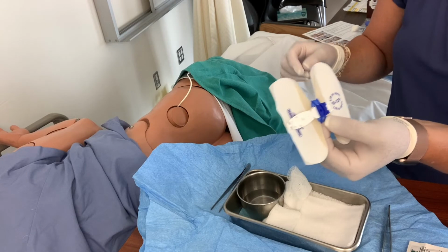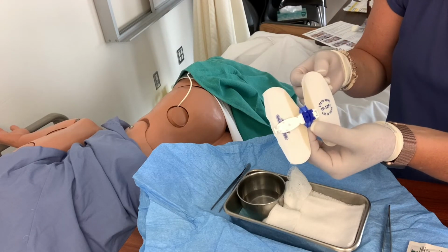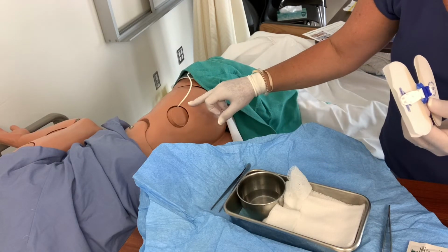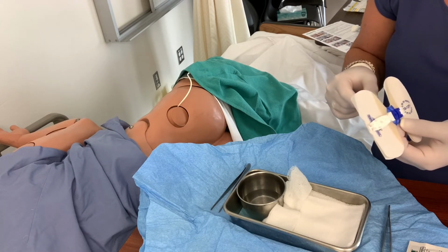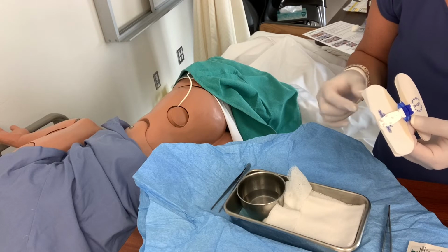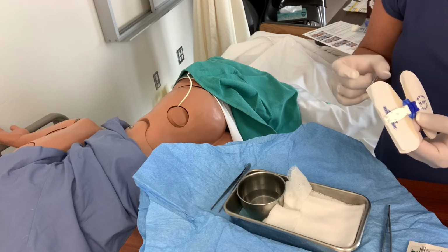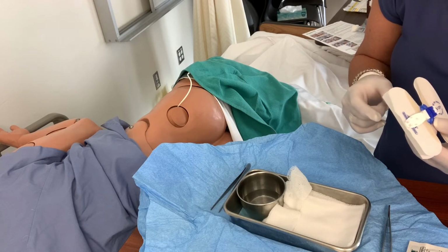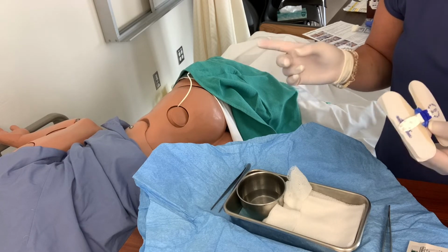So this is where you need to be careful that you're not touching something that you shouldn't and dislodging it because you're not paying attention. At the insertion site, when it's inserted, typically the physician inserting it will have some type of marking indicated on it where it was inserted. So it might be a little piece of tape, it might be a black marker, but if it's been moved more than 5 centimeters, they need to be notified to see if it's actually still a functional tube. So you just want to be really cautious.